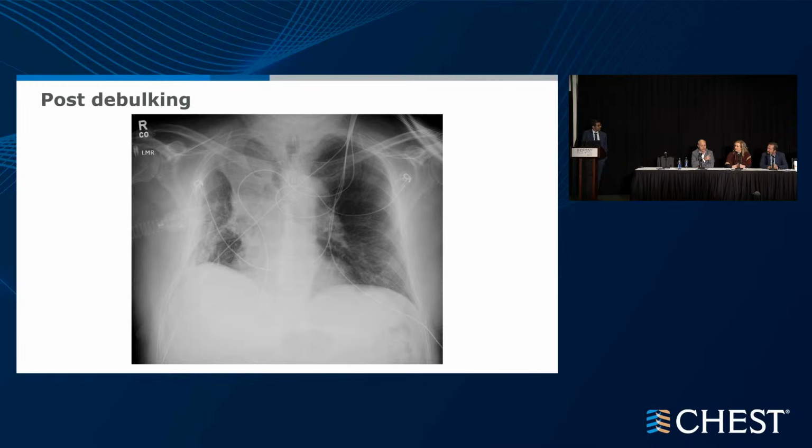I used to be exactly what you're doing, Carla, like if you can avoid the foreign object. But that paper by Hervé Dutot from France made me change my practice a little bit, where he randomized people to stenting immediately after the debulking versus debulking alone in patients with exophytic endoluminal disease. We're not talking extrinsic compression or mixed. Exophytic endoluminal, and people in the stenting arm had fewer procedures than the control arm. So the fact that they actually got a stent day one, they actually did better from that standpoint.